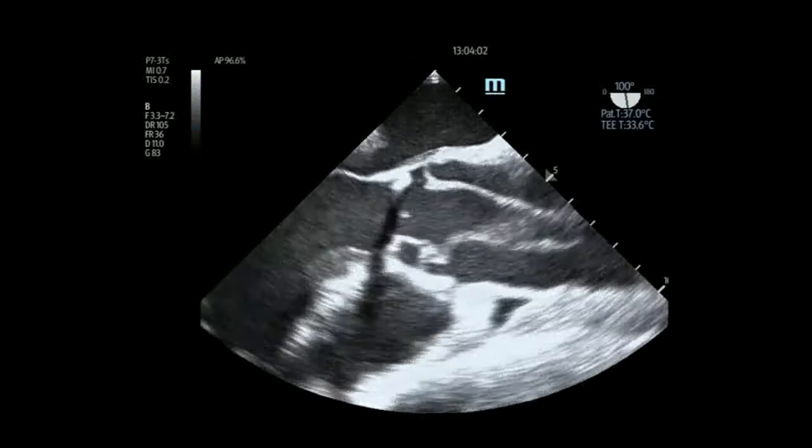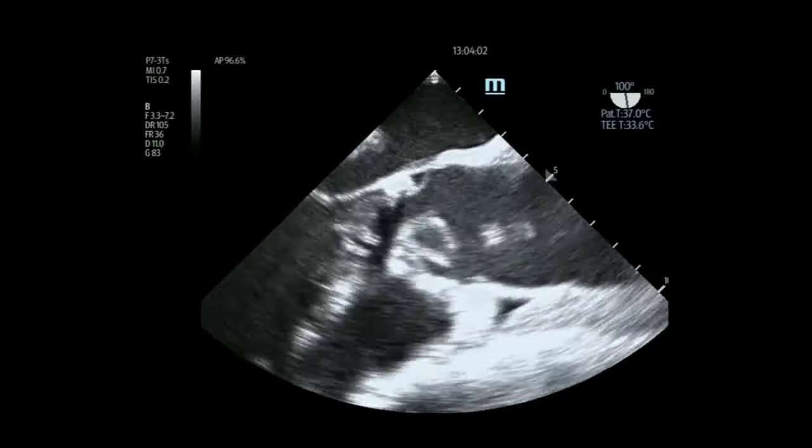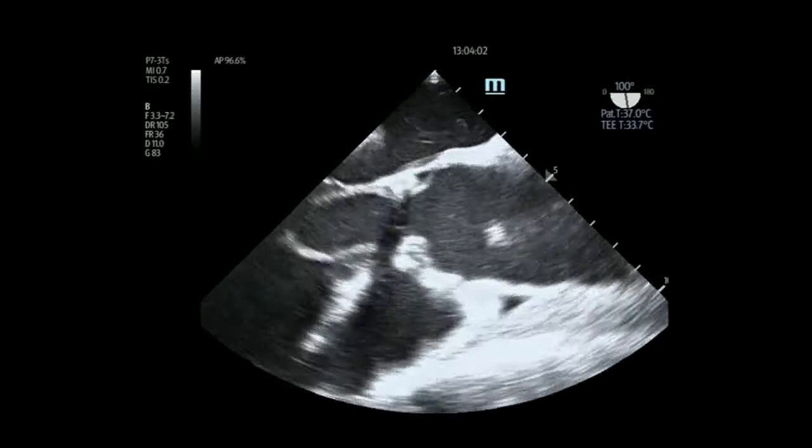Here's a dissection where the cardiothoracic surgeon and cardiologist came and said they'd never seen anything like that. This is also incompatible with life. The head of our cardiology department wanted to publish this.